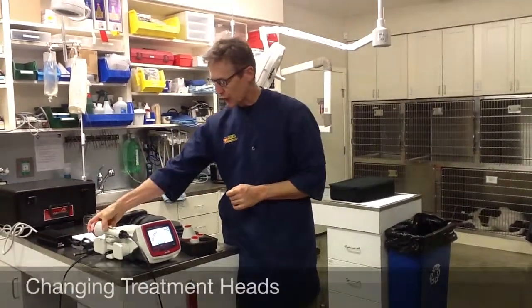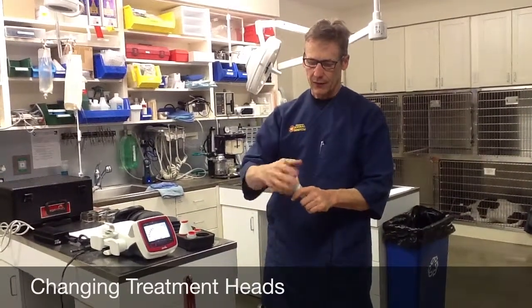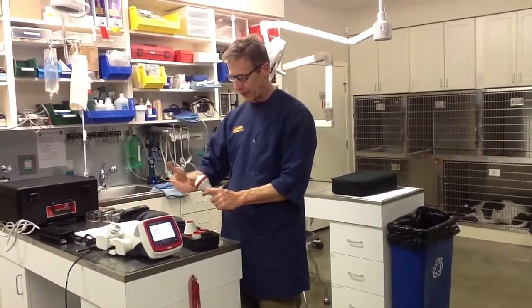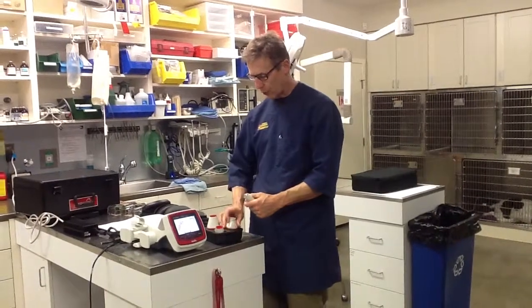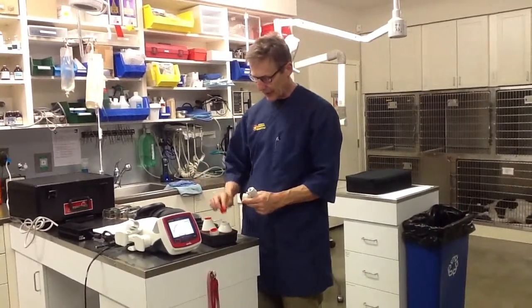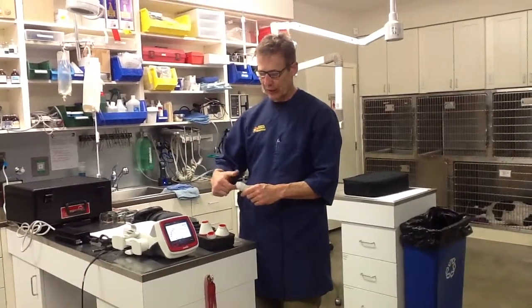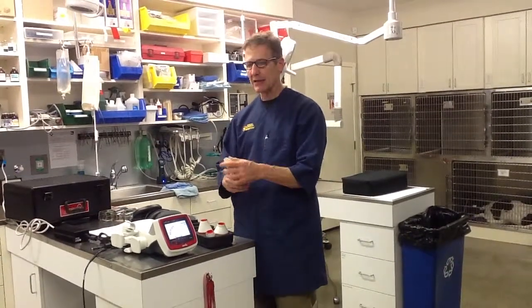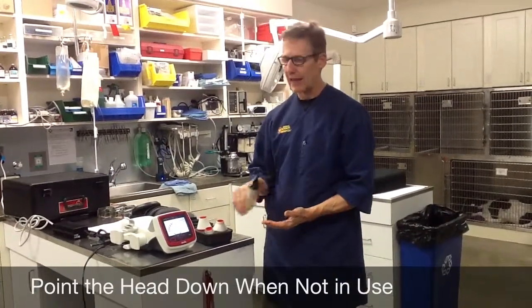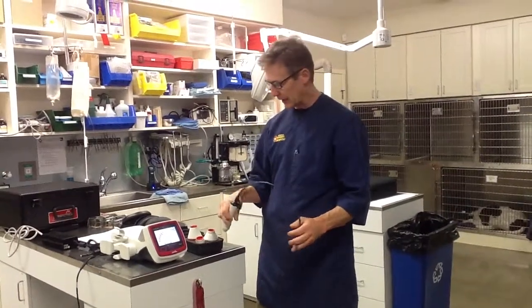Let me show you how you change the head. Treat these like camera lenses — keep them relatively clean and safe. When I'm taking this off, if I do it over the holder, that's a soft surface in case I drop it. Put your lens cap back into that space so hair and dust don't collect, then spin on your next handpiece. Always have it pointing down and away from people's eyes, whether it's on or not — that's a good habit to get into.